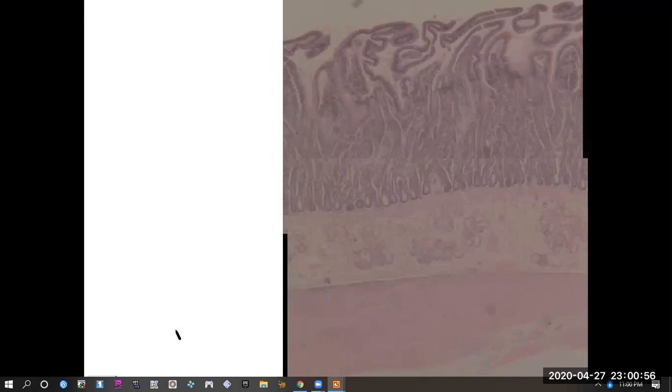So now here for the duodenum, we see the distinguishing trait for the duodenum, that first term, the villi. We're looking at these slender spikes here. And lining right on the surface of the villi, we're once again going to see simple columnar epithelium.